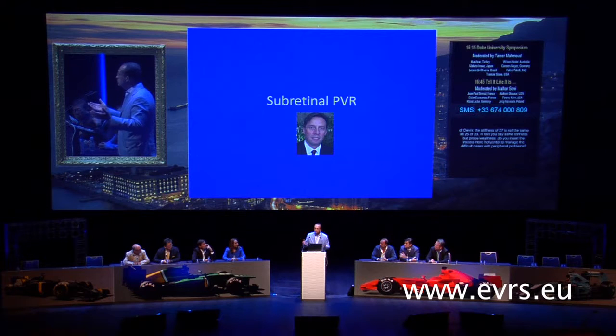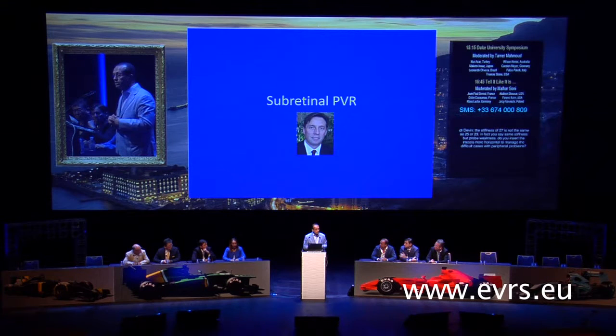And maybe some of you, because especially in Europe and in Japan also, a lot of physicians would do the combined phaco and retinal surgery. And one of the things that is coming out is we have to know the type of intraocular lens that we put, especially retina surgeons. So some of the intraocular lenses are hydrophilic lenses.